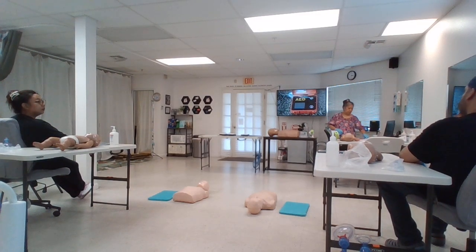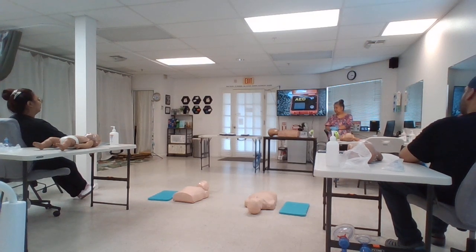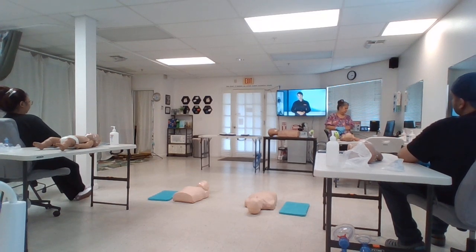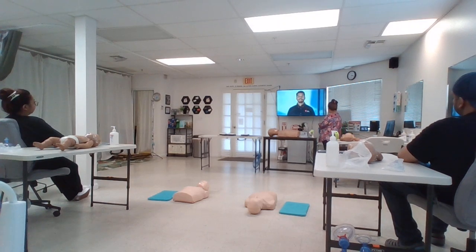Regardless of the type of AED, remember to turn it on first and follow the audible prompts that will lead you through the rest of the steps. AED kits may include additional emergency equipment, such as scissors, razors, wipes, gloves, and a barrier device. These items may also be found in a separate emergency or first aid kit. We'll pause here to allow you to get familiar with the AED in your class today. Your instructor will show you all that's included in the kit and demonstrate the correct way to place the pads on a victim.